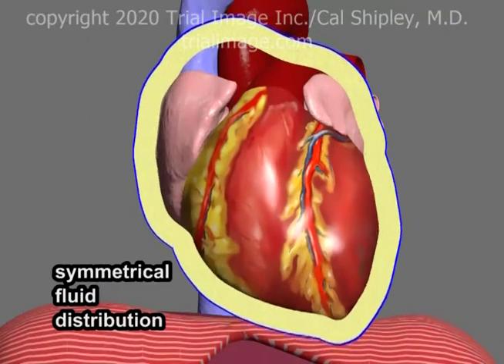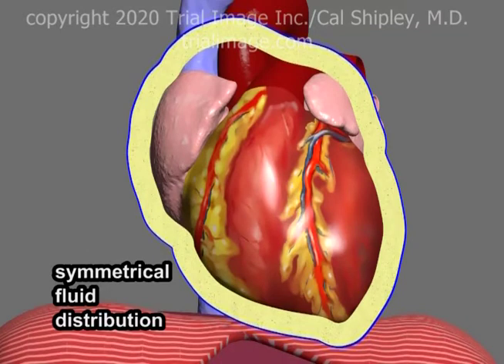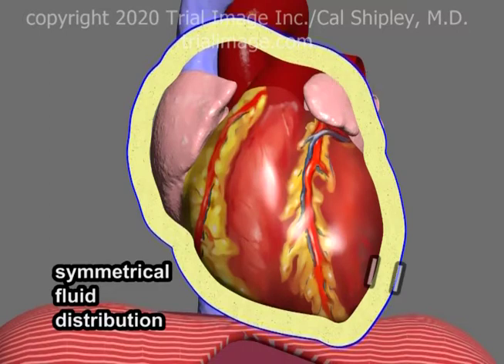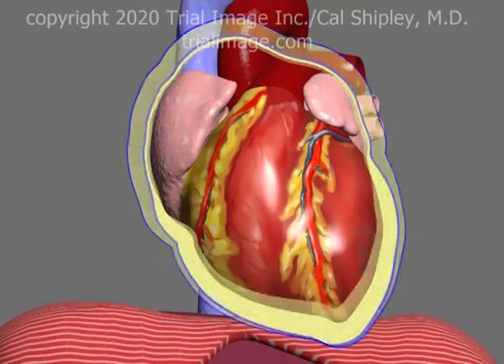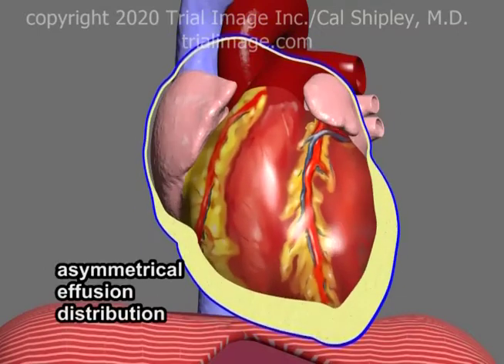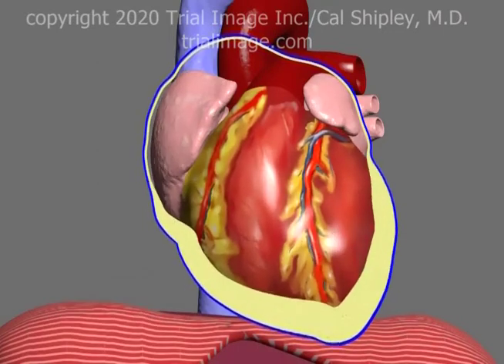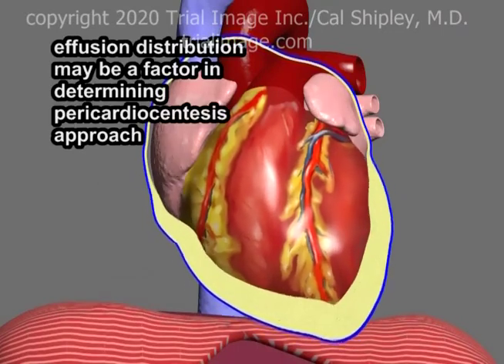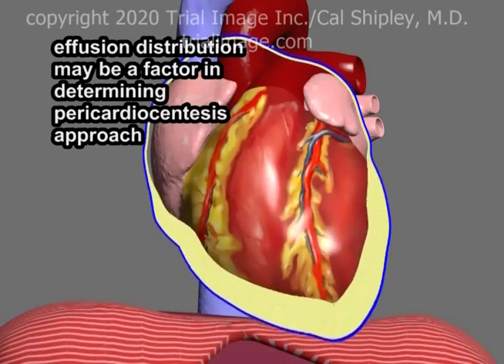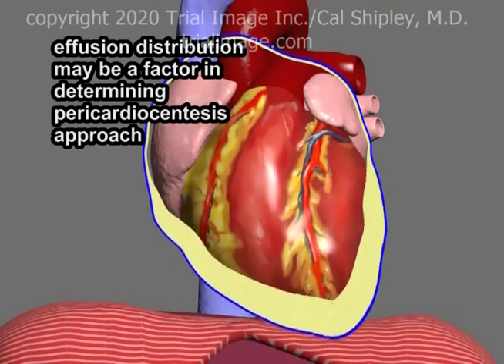This example shows a symmetrical distribution of the pericardial effusion around the heart, where irrespective of where it is measured, the pericardial fluid has about the same depth. However, the pericardial effusion is very often asymmetrically distributed, as in this example, where the majority of the fluid is contained in the inferior, or lower, aspect of the pericardial sac. The distribution of the effusion may be an important determining factor in choosing which pericardiocentesis approach to use.